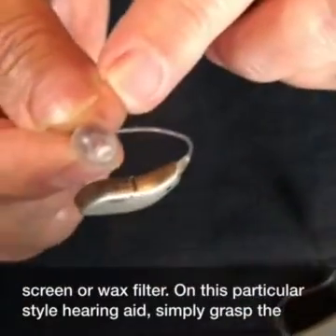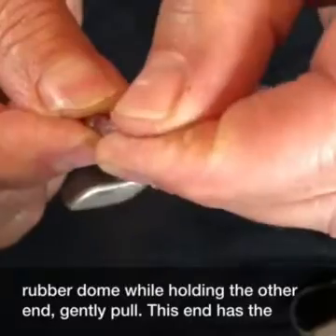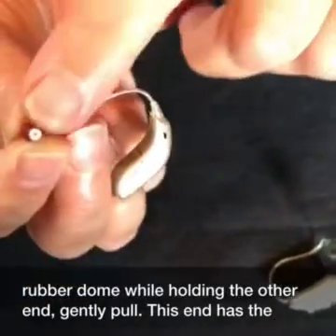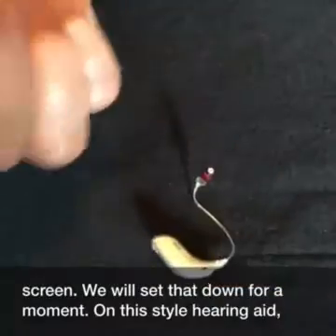On this particular style hearing aid, you will simply grasp the rubber dome while holding the other end. Gently pull. This end has the screen.